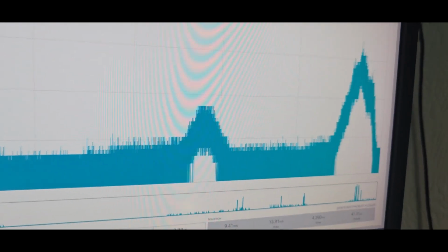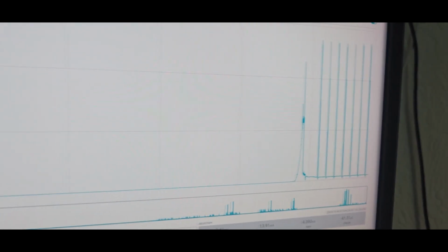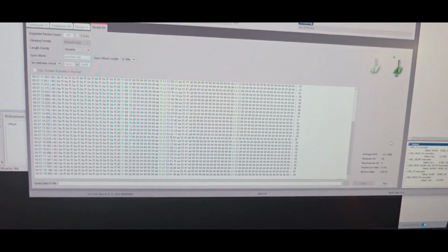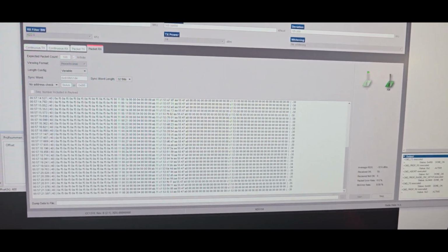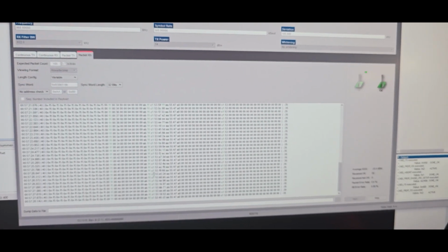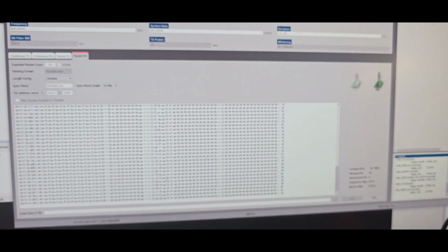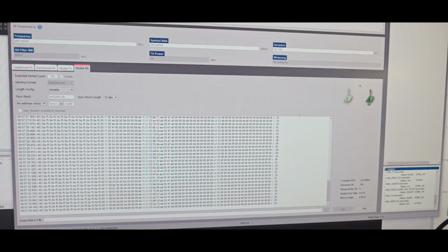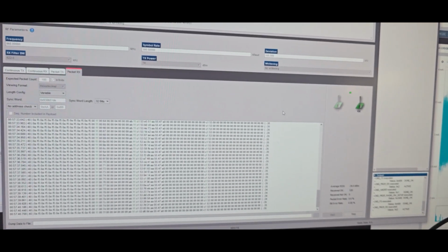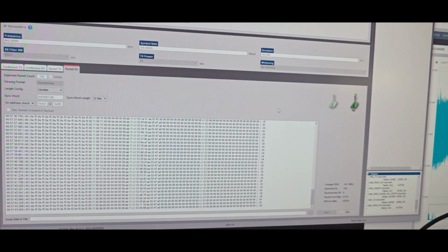And by shining just a light onto it, you can see that the current consumption goes up every now and then. And if I hit just the right spot, you can see it's really activating, and the camera is also transmitting data. This is right now at 300 kilobits per second. It's basically just information data, a bit of header. You have a TX counter, an RX counter behind it, the ID of the camera, which would be C153, a CRC and some more values. This is also done at 868 megahertz, and there is a flag inside of the camera to be a US version for 920 megahertz.